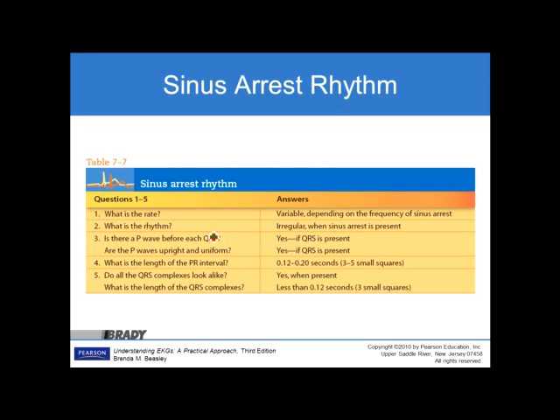The sinus arrest rhythm. The one thing that's going to stand out as we're looking at the 5-step process is this section here. What is the rate? And that depends on if we initiate a sinus arrest or not. So if we have a sinus arrest on this, there's going to be a blank spot where something should be going on but is not.